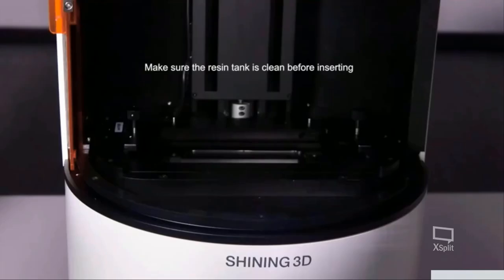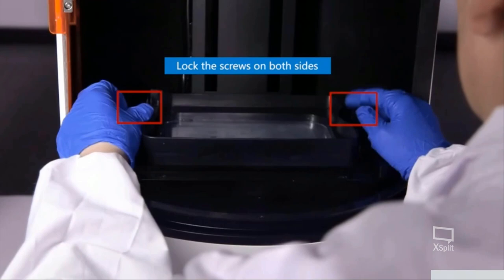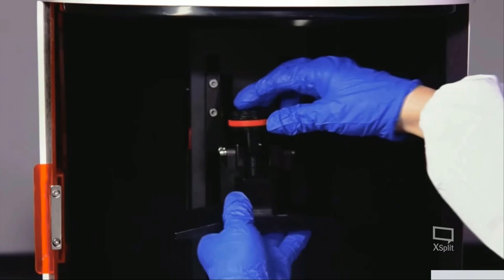Okay, now together, if you agree, we can have an overview of the first step that is mandatory to do in order to start a printing phase correctly. Once the resin tank is placed inside the printer, we are ready to mount the building platform. Like you are seeing in the video, it's very easy to place it in the correct way.